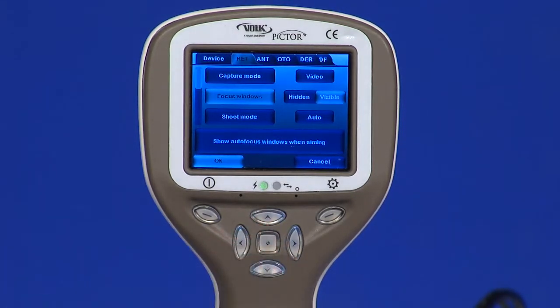Focus window. The focus window can help users position the image. The focus window can be moved on the screen by first pressing the middle key until the icon F appears in the upper right corner of the display, and then the arrow keys will aim.